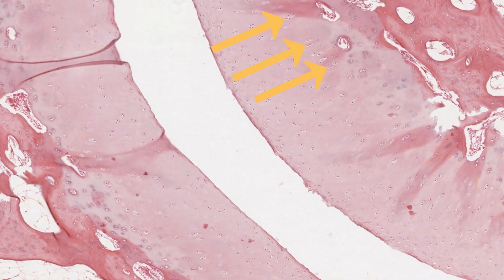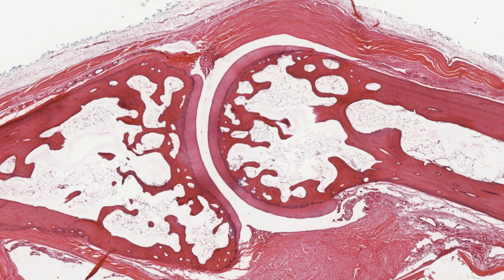Look very carefully and note a change in the staining or bluing of the cartilage matrix as it becomes calcified. This is the calcified zone. Here is a section through an additional joint. There is no epiphyseal cartilage left in this joint from a mature individual.